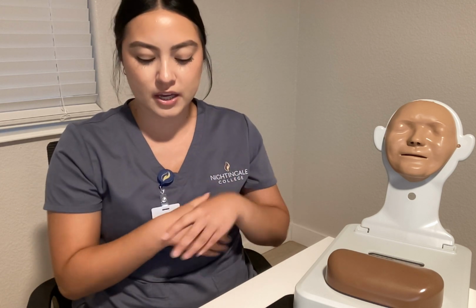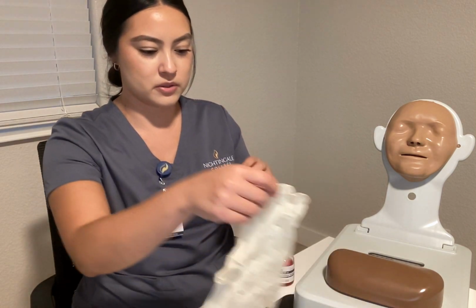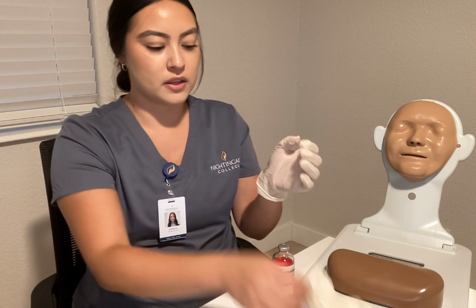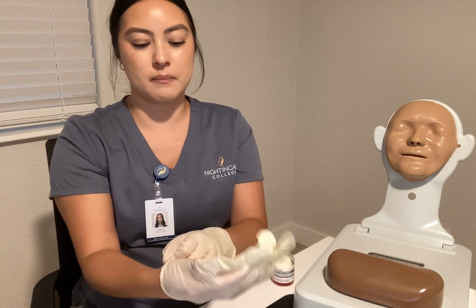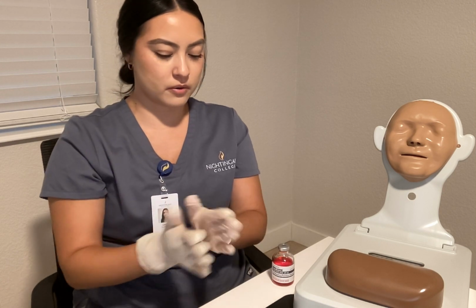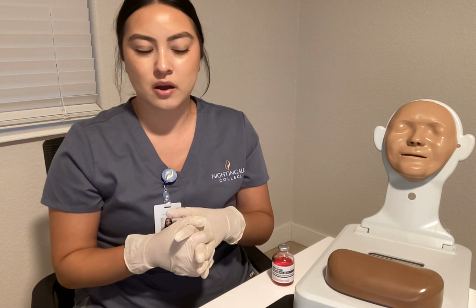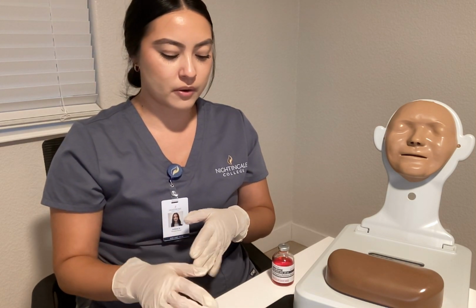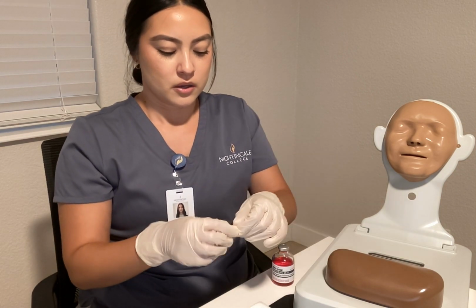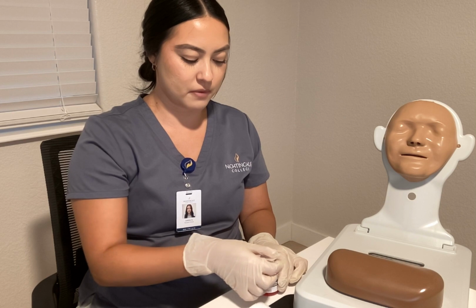Again, I would go ahead and perform hand hygiene. Next, we're going to take our medication, which is here, and then I'm going to don my gloves. Again, the order is going to be 0.1 ml of Tuberculin. Okay, so before we go ahead and start, I do this quite often within my office, so I would make sure I have my supplies, and then we're going to take your alcohol pad and cleanse the top of the vial.